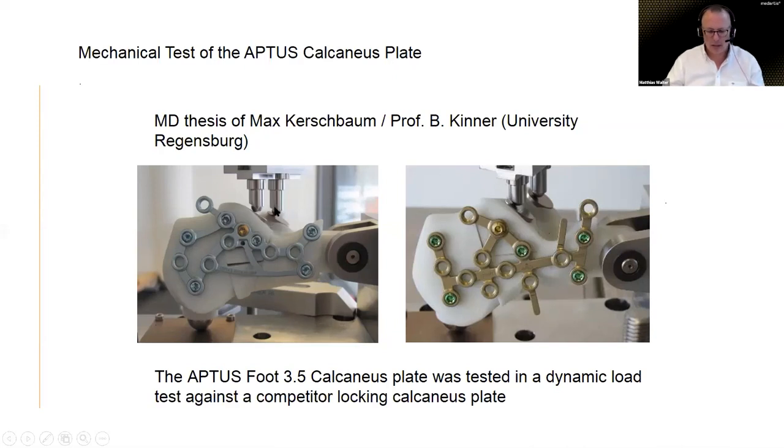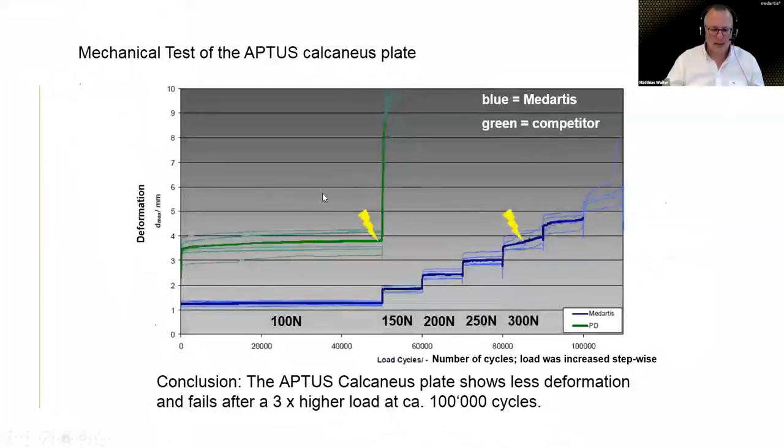We applied then obviously a pulsing load, and we had the effect that the Sanders construct, which was a standard thing, died relatively early. After 50,000 cycles at just 100 Newton, I would say 100 Newton is 10 kilograms, okay? Don't forget, 10 kilograms is nothing, okay? And after 50,000 cycles, the Sanders construct already died and displaced 3.5 to 4 millimeters. So the whole thing just twisted and turned, right? Therefore, the likelihood of having a good healing is most possibly not what we want to see.